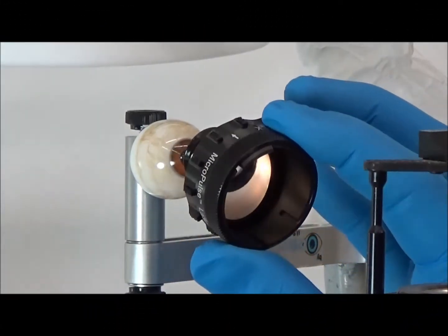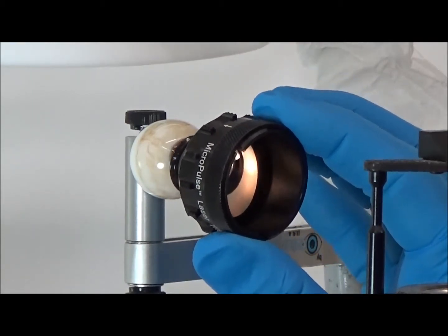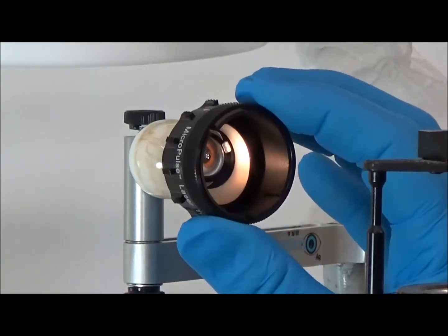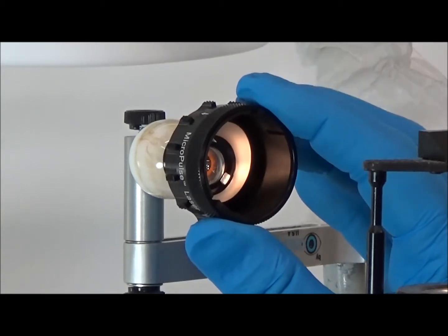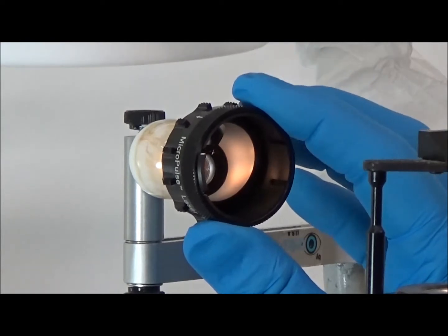Note the lens can be held between the thumb and the first finger during use. When the magnets are engaged, the lens can be manipulated in the usual manner. When desired, the lens can be easily rotated by moving the lens tabs from one indexing position to the next with the middle finger as shown.